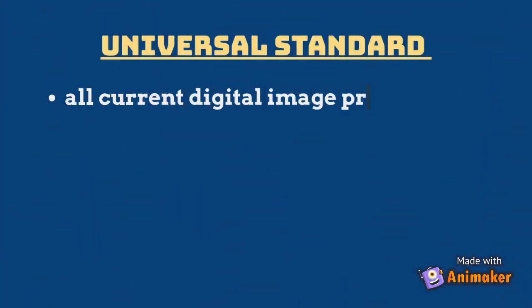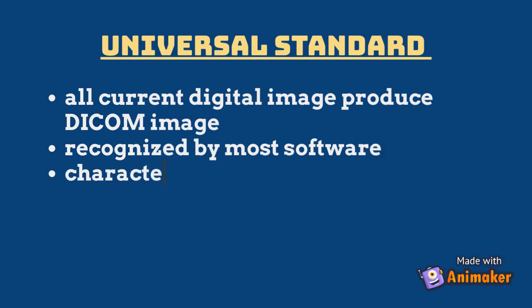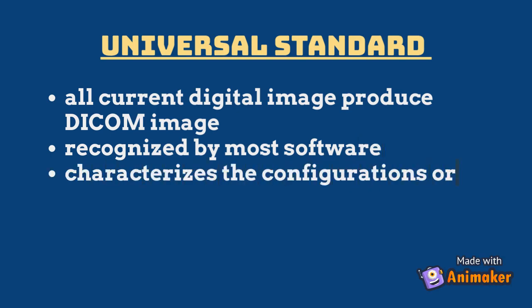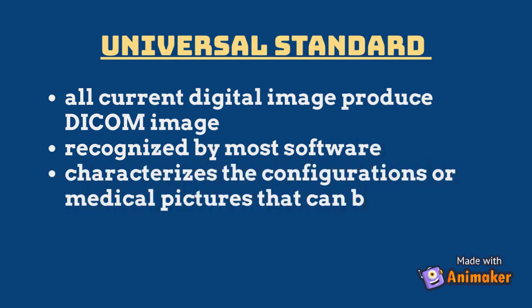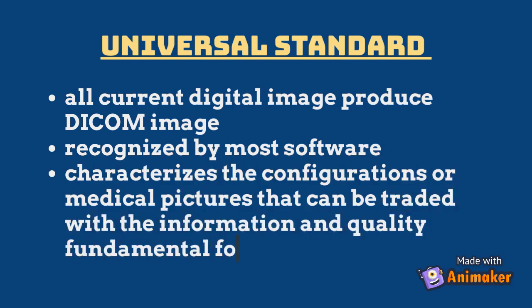DICOM is a universal standard. It is because all current digital imaging devices produce DICOM images. These systems are recognized by most of the software. This standard characterizes the configuration of medical pictures that can be traded with information for clinical use.